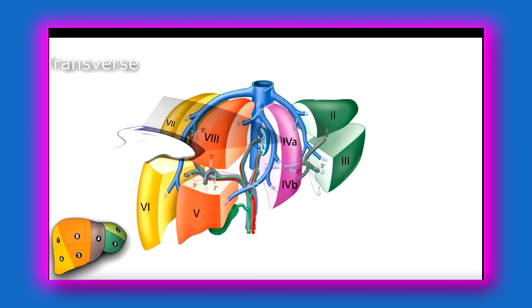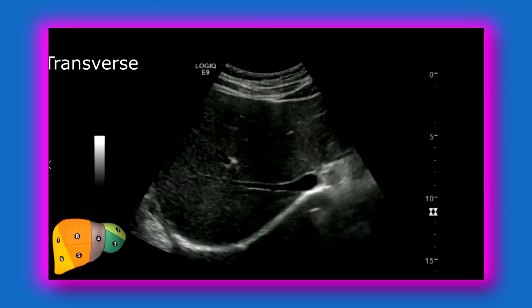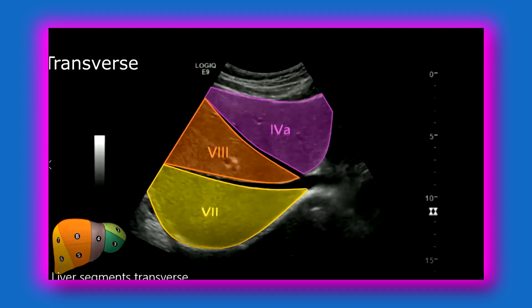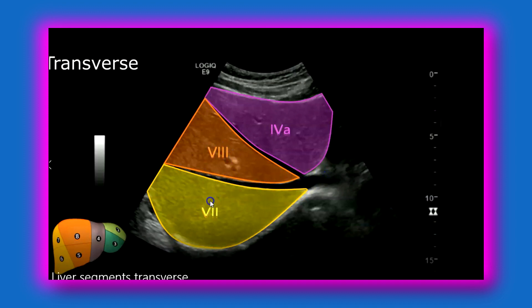Now scanning the superior segment of the right lobe in transverse — there you have your hepatic veins. Here you have 4A, 8, and 7, so you're scanning around right here. You'll see that your middle hepatic vein separates 4A from 8, and your right hepatic vein separates 8 from segment 7.